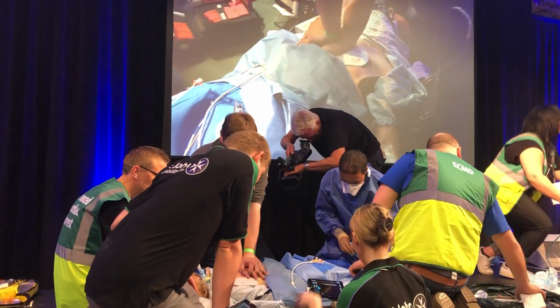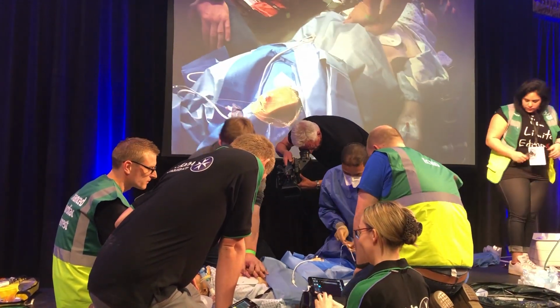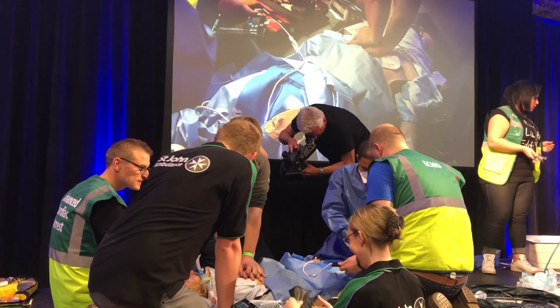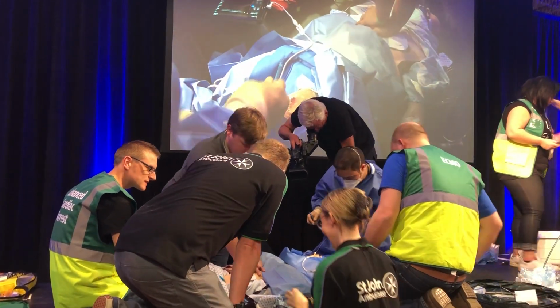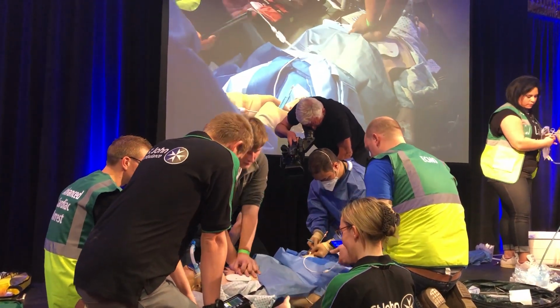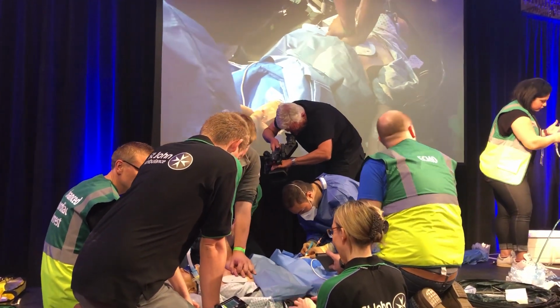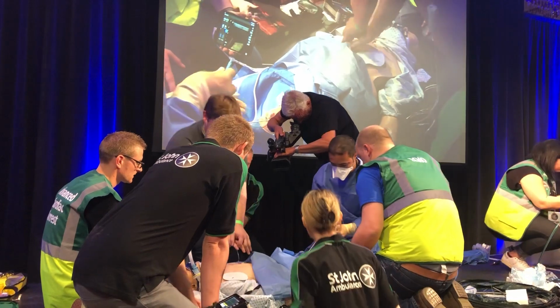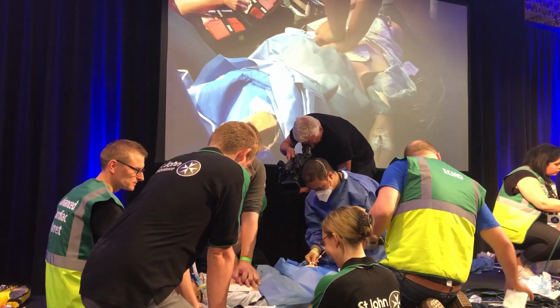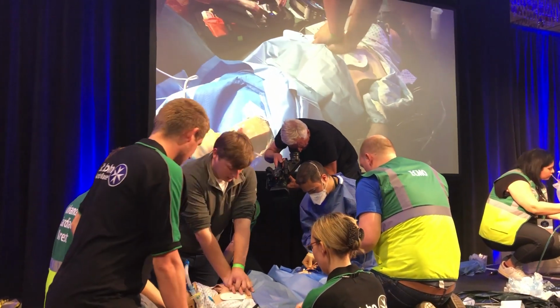So you can see that there are challenges with compressions when trying to thread little wires. You've seen the charts that show that CPR generates pressure, and when you stop compressions, it falls back down and takes time to build up. So in a normal resuscitation, you're at pains to avoid interruptions in compression. However, for someone that's going to hit criteria, or looks like they might, ECMO is the thing most likely to be of benefit as they enter the refractory stage.